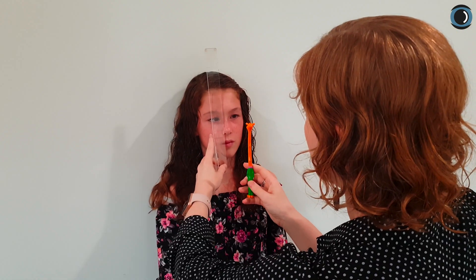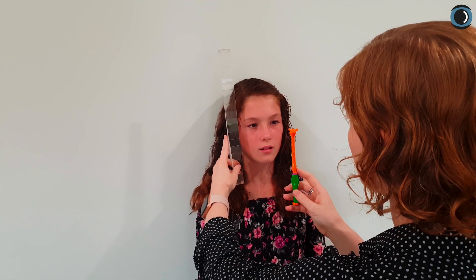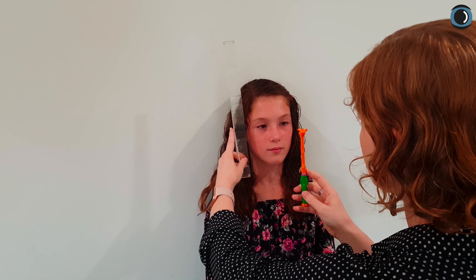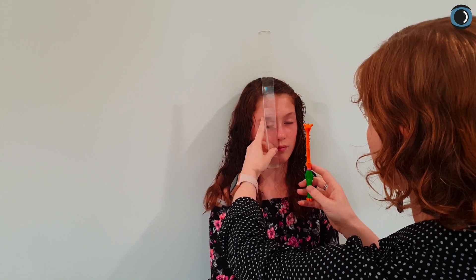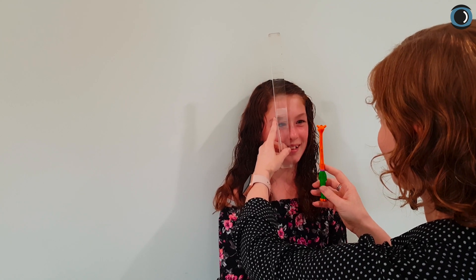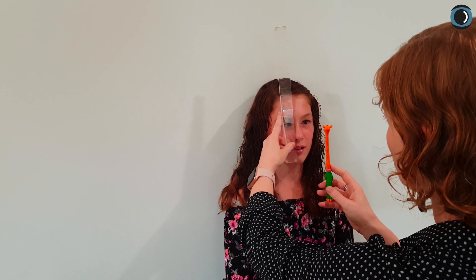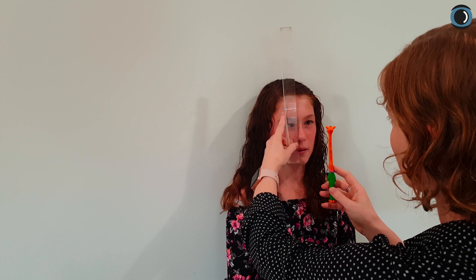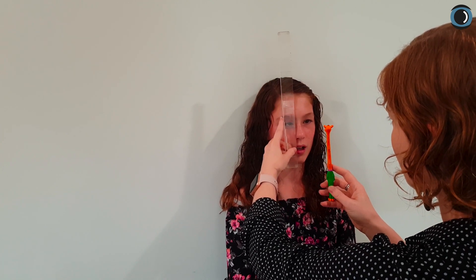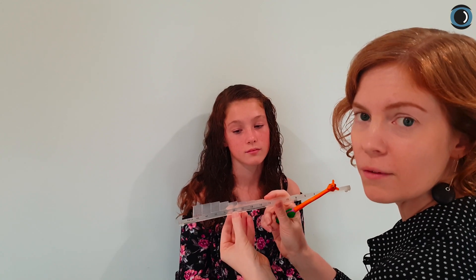We're going to start from somewhere near the middle because I know she can do it. Watch for her convergence and her recovery as well. We're trying 30 — can you get him? It's a bit fuzzy. One and a bit — so we haven't quite got that one. Break and recovery was at 25, which is pretty good and we're happy with that.